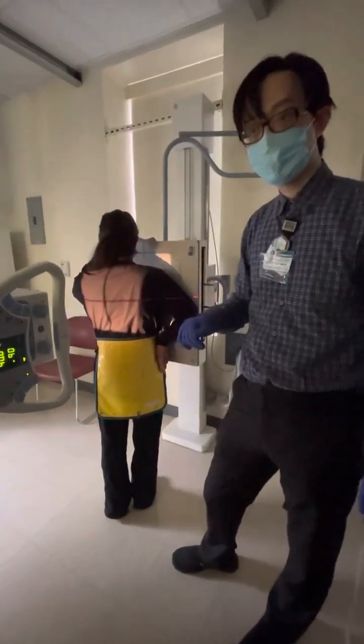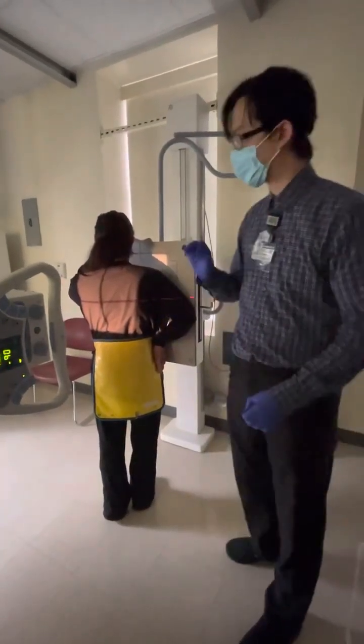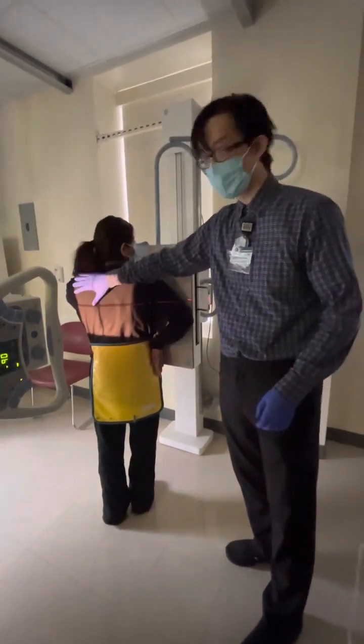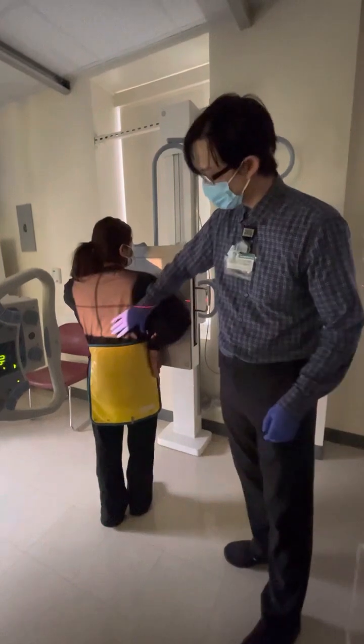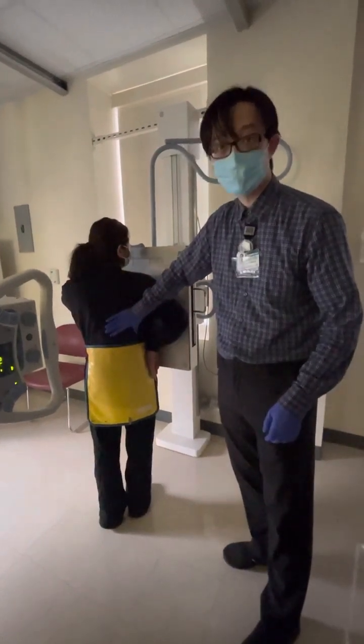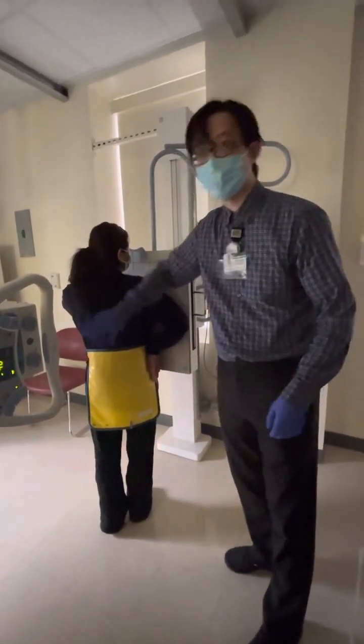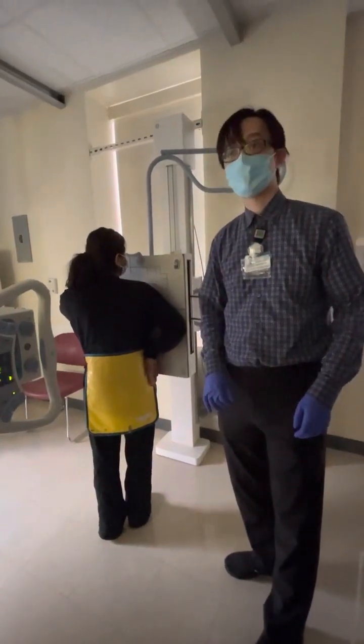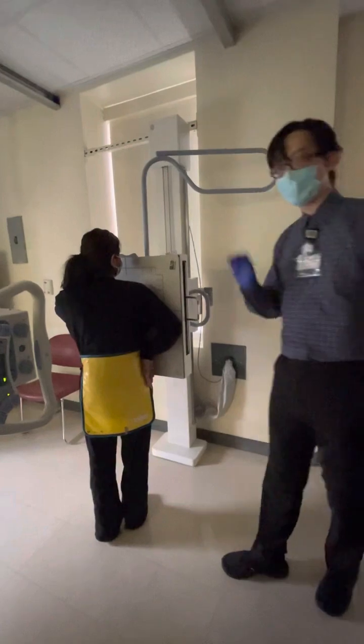Does that make sense? So this is bilateral because even though my side of interest is the left side, I am still capturing the right side on my image. I'm capturing both sides on my image. Does that make sense? That is bilateral.